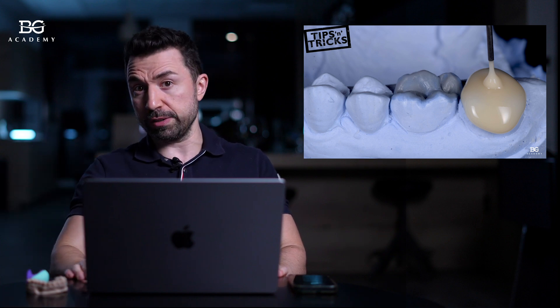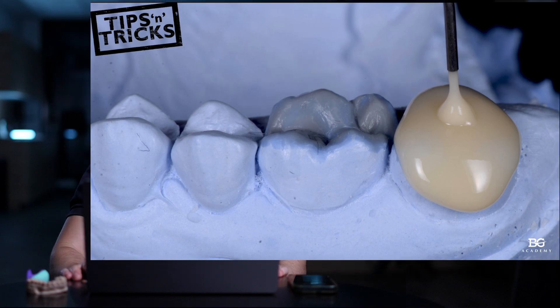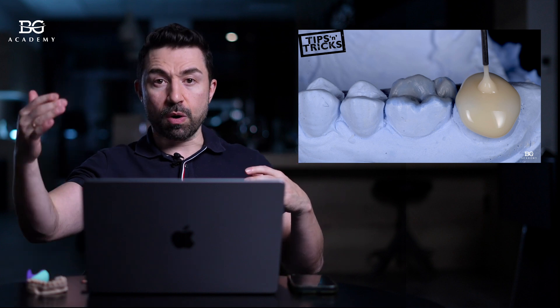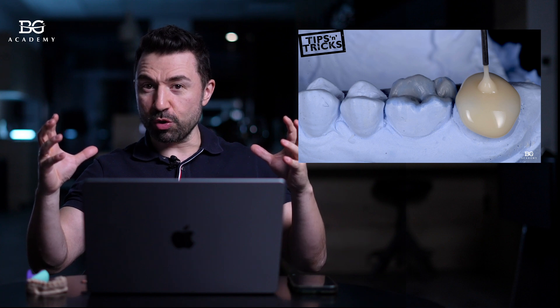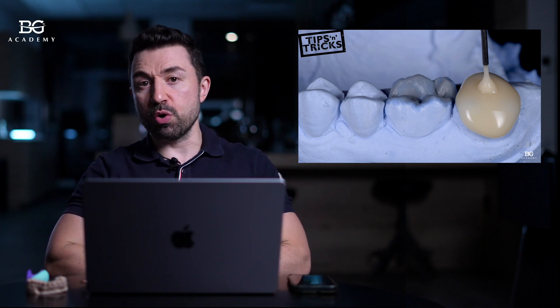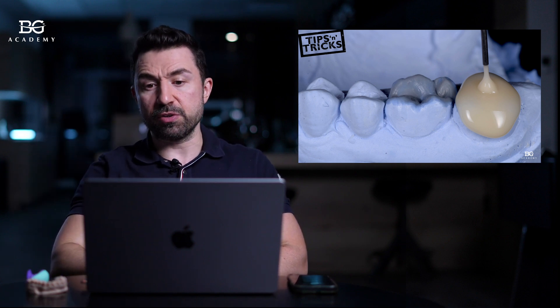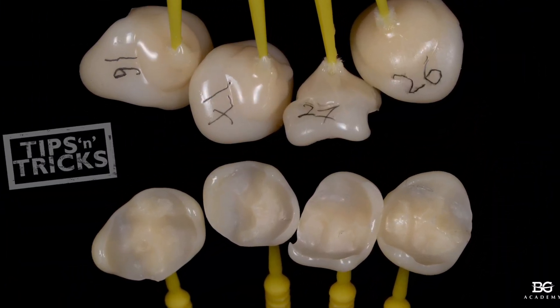The trick here is: we use flowable composite to make an occlusal stamp. As you can see, I make this occlusal stamp not just over the occlusal surface, but I also extend the flowable composite to the buccal and to the palatal surface — creating a so-called semi-crown of the occlusal surface from the wax up model. This gives you superior stability when working with this stamp in the patient's mouth. Here you can see multiple stamps for different teeth, as we are going to restore molar teeth in this case.